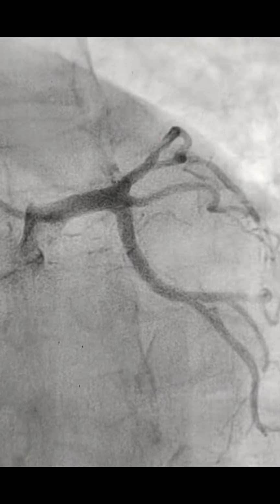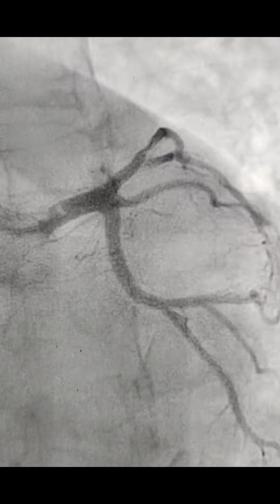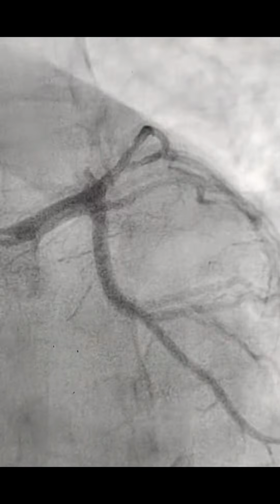So this is the angiogram, and I can see there is a complete ostioproximal LAD thrombotic occlusion, and there is a dual LAD system. The first LAD, the major LAD, is a complete ostioproximal block, and the second LAD has a proximal thrombotic lesion. You could see that it is almost 80%.